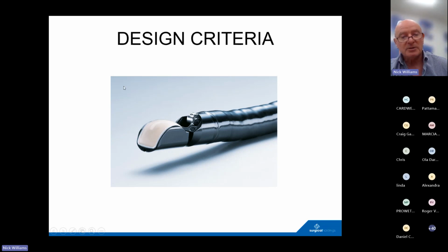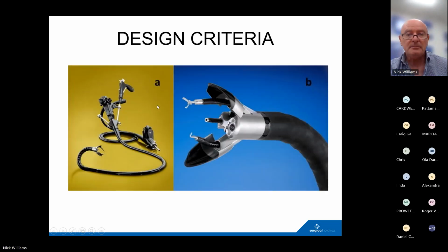So that's sending out ultrasound in that plane, and you then use what's known as FNA, fine needle aspiration, so effectively a biopsy needle that comes through there, and you look at it in real time in the tissues to see where you are to take your sample from the right area. So again, very complicated scopes and potentially very expensive if you damage them.